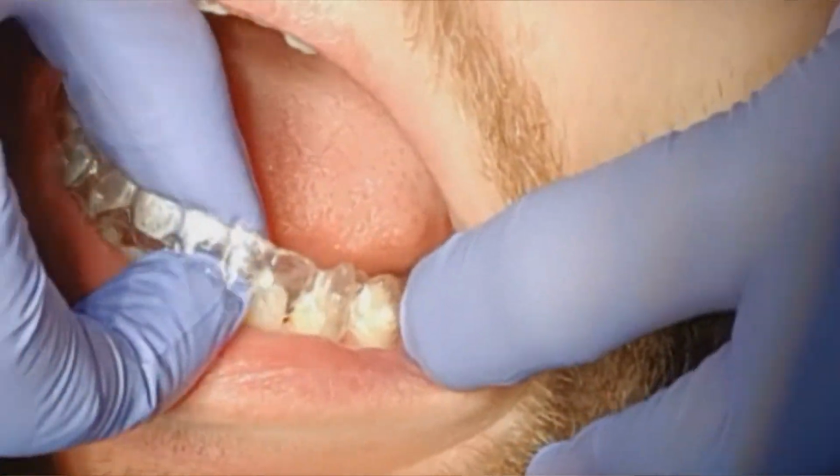They didn't really look at the attachments or ask me how they felt. It was very much put them on, get them bonded, make sure the attachments fit, off you go. So that was a little bit weird because it was only once I'd got home later that day and had to remove these things for dinner that I realised what these things actually felt like. So it is quite a rough experience to begin with because this material kind of goes everywhere, it dries, it can form kind of sharp edges on your teeth, little spikes here and there. So it's a bit of a shock when you get home and actually realise what that feels like.